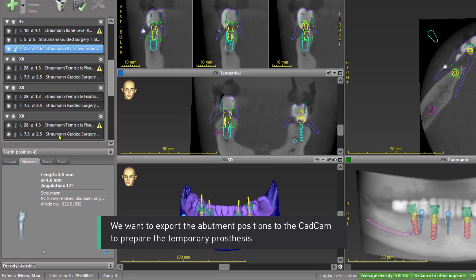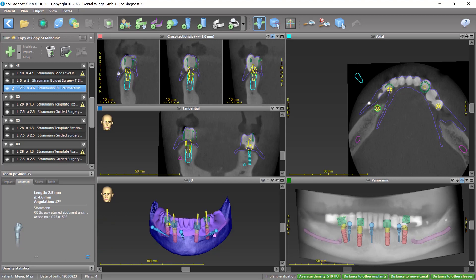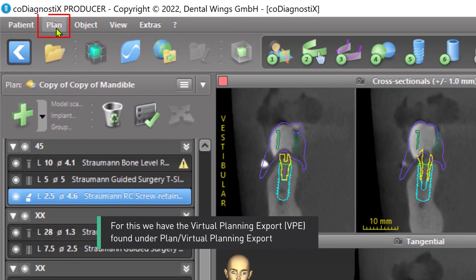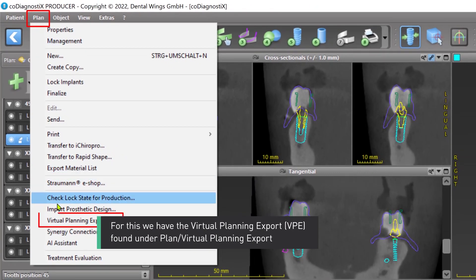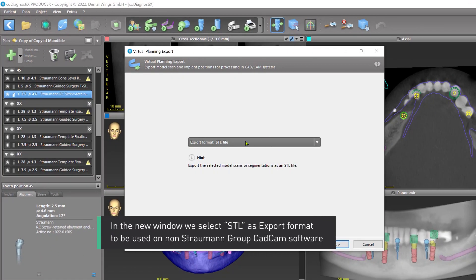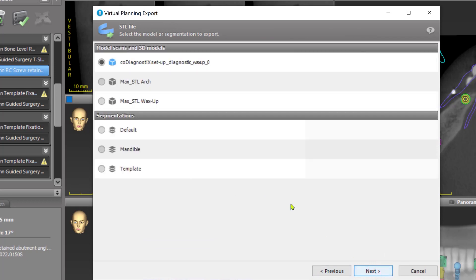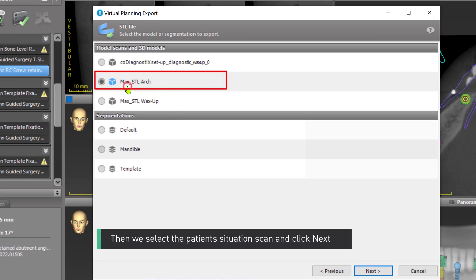We want to export the abutment positions to the CAD-CAM to prepare the temporary prosthesis. For this, we use the Virtual Planning Export found under Plan > Virtual Planning Export. In the new window, we select STL as the export format to be used on non-Straumann Group CAD-CAM software, and we select Untouched Export. Then we select the patient situation scan and click Next.